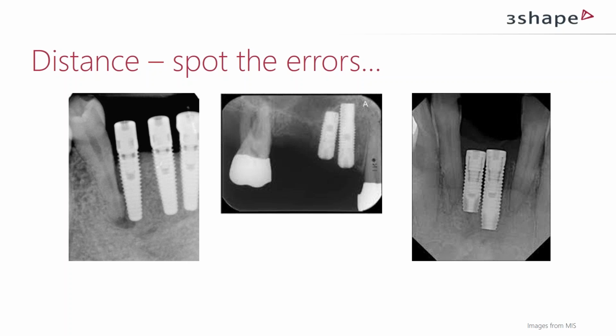This is why we do this webinar today. I think the laboratories doing this for the dentist should sit down and talk about this, maybe use this webinar as a planning and educational tool, and discuss with the doctors to get the best possible planning for them.